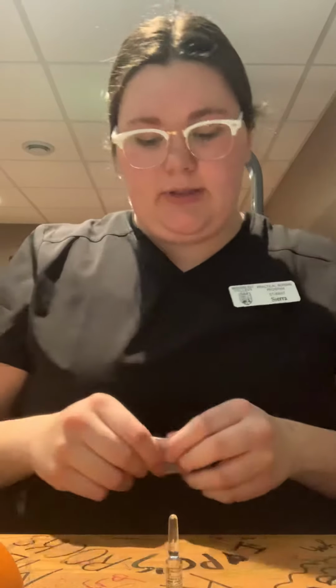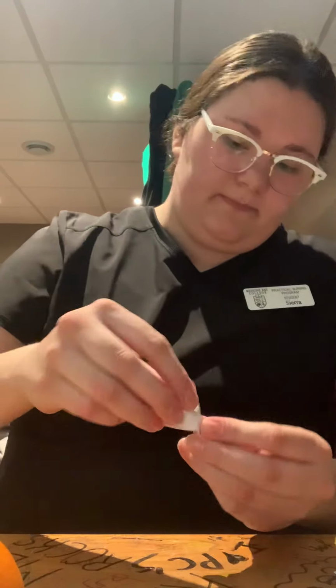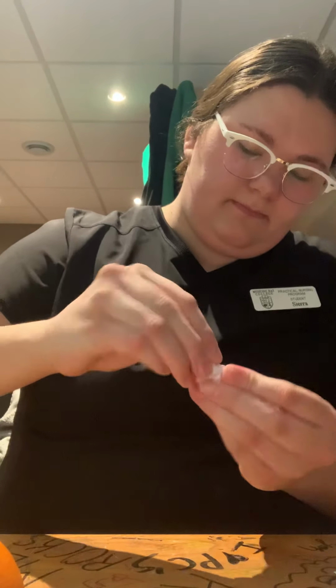We need to clean our amp before breaking it. So we're going to clean the neck of the amp. Nice and good, and let this air dry.